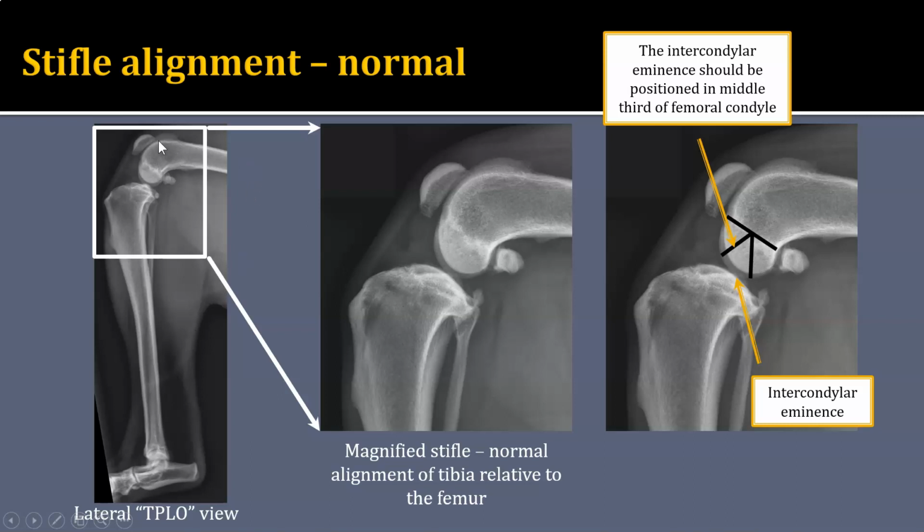And what that means is that the stifle is in 90-degree flexion and the tarsal crural joint is in 90-degree flexion. And basically, when you position the patient like this, it is putting them into tibial thrust. And so we can look for alignment or lack of normal alignment.